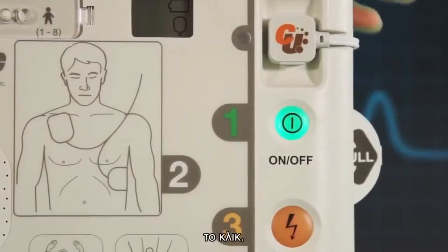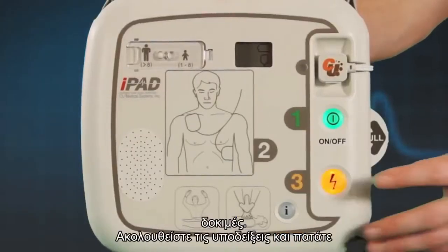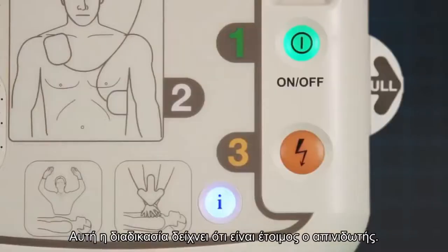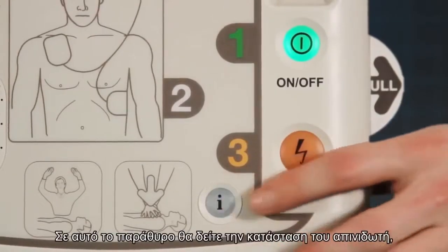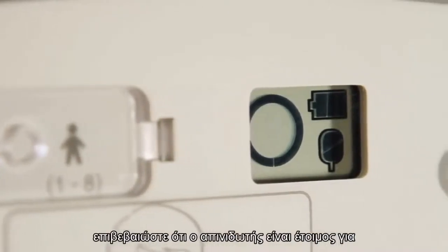The iPad SP1 AED will now go through a series of self-tests. Follow the prompts and press the flashing buttons when told to do so. Once this process is complete, the AED will turn off. Check the unit status window to confirm that the AED is now ready for use.